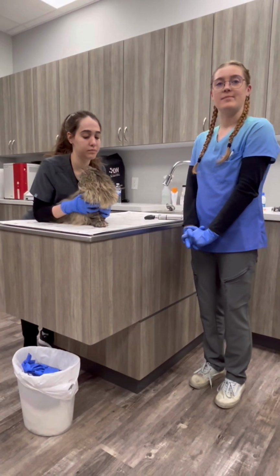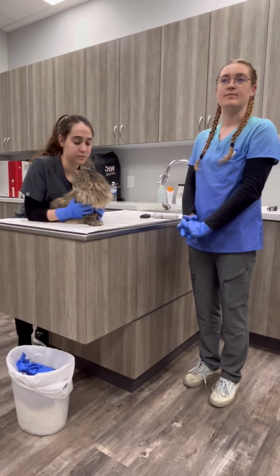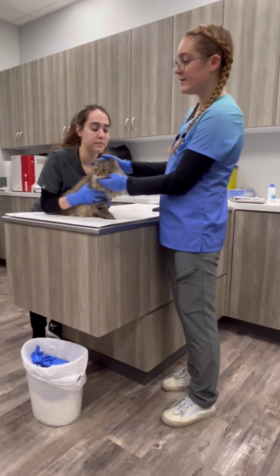The dye upon application travels across the surface of the eye and then down into the nasolacrimal ducts, which appears as green nasal discharge on the patient. You can just turn the light on. I'll be using the blue light setting for this assessment. And there are no abnormal findings upon doing the fluorescent dye test.